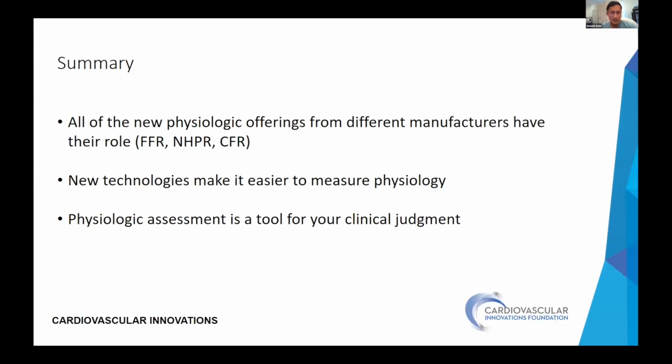So in summary, all the new physiologic offerings, you saw that we had 4 different companies that we showed here. They all have different roles, including FFR, non-hyperemic pressure ratios, and CFR. They make it easier to measure physiology, but ultimately physiology is just one tool along with imaging for your clinical judgment. So you shouldn't be locked in to doing something just because of the physiology. Thank you.